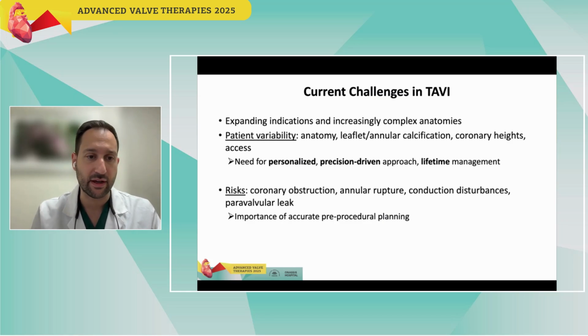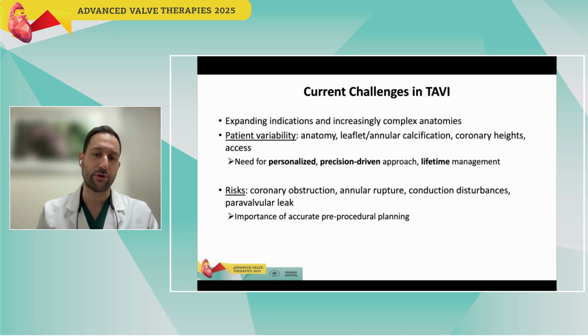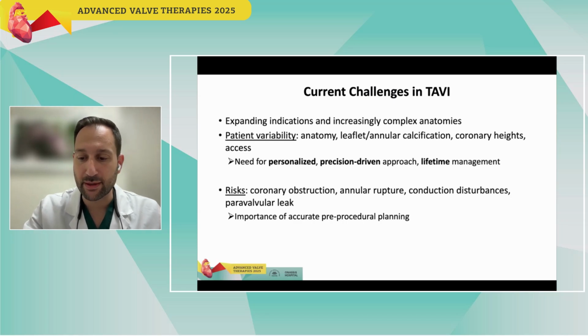There are several risks, as we know, associated with TAVI, including coronary obstruction, annular injury or rupture, conduction disturbances, paravalvular leak. So it's very important to have a very accurate pre-procedural planning to minimize the risk for these complications.